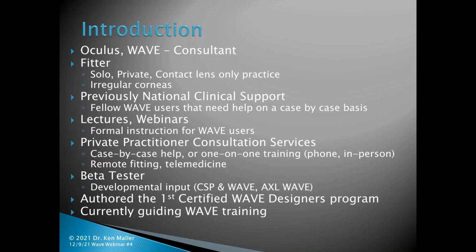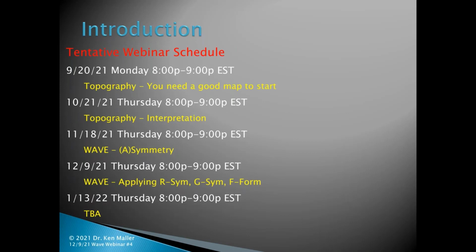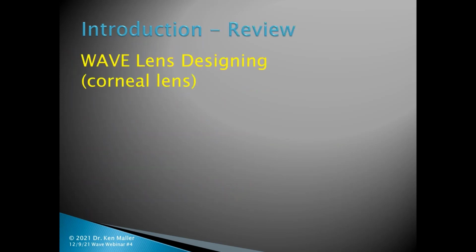I do beta testing for the CSP, the WAVE, and the AXL WAVE, which I'm currently working with now. And I did author the first WAVE certified designers program, and I'm currently guiding the WAVE training so that you guys can be more efficient in designing up your lenses. Tonight we're at WAVE, the fourth one down, WAVE applying R-Sym, G-Sym, and freeform. We have a lot to get through tonight, so I might be going a little bit faster than in the previous webinars.